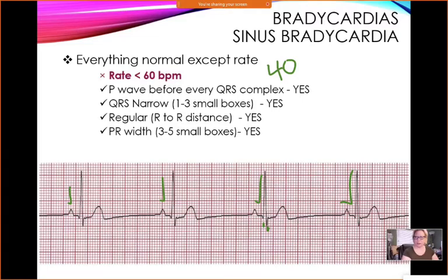And then is it regular, R to R? What you'll do on that one is if it looks regular, it probably is regular. We'll show you irregular later.